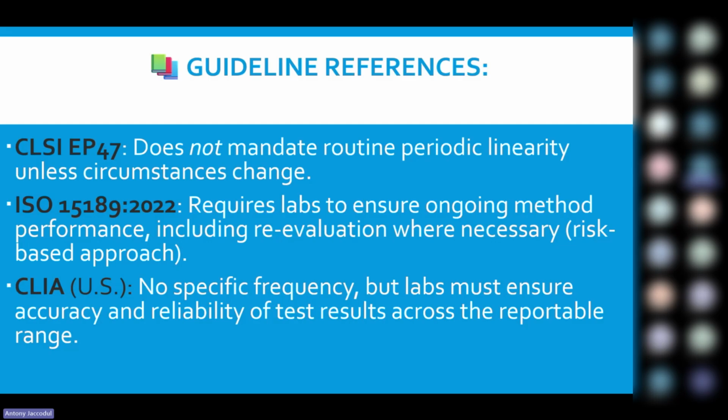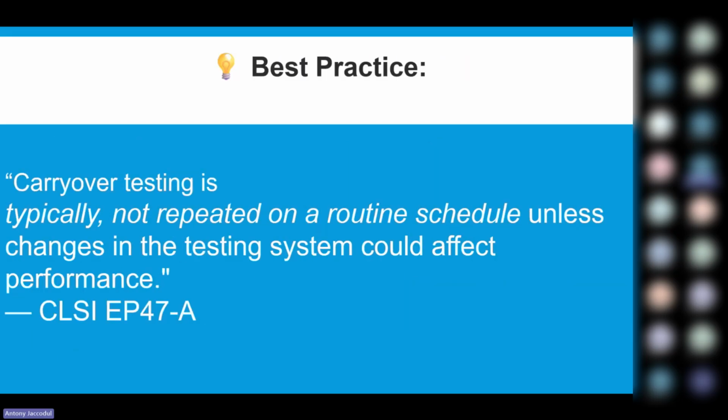If you look at the CLSI EP47 document, you will be able to get how to do that. And if you look at a risk-based approach to managing your ISO 15189 protocols in your lab, carryover should form part and parcel of your components. You can also use a lot of CLSI guidance documents to get more information there. Best practice is that carryover testing is typically not repeated on a routine schedule unless changes in the testing system could affect performance. So you need to see what the risk-based approach is for your testing.